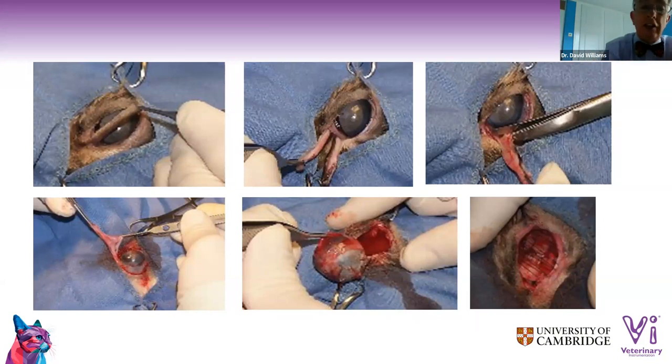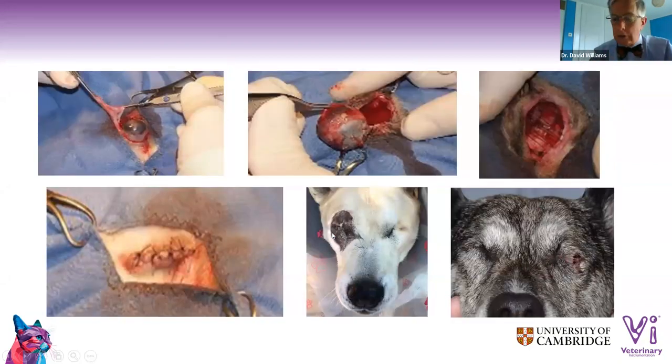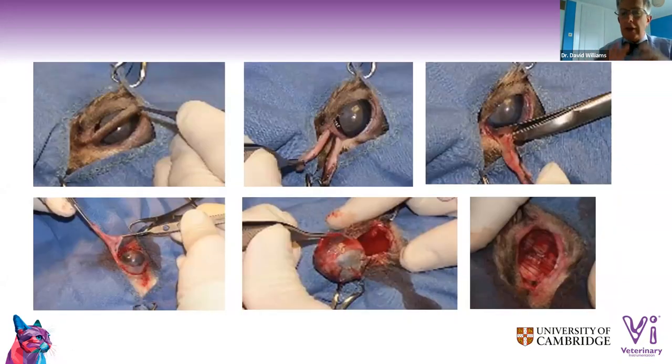What he does first is cut the eyelids first. Don't bother doing that. Keep the eyes open, and then just cut around the conjunctiva, as you're seeing down on the lower left here. So just cut the conjunctiva all the way around, and then cut the lids, and then cut the extraocular muscles bit by bit as they attach to the globe. And if you do that, then you won't see a load of bleeding. Look on the lower right, there's hardly any bleeding.